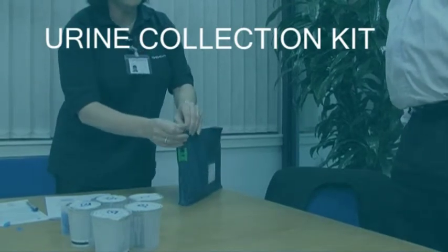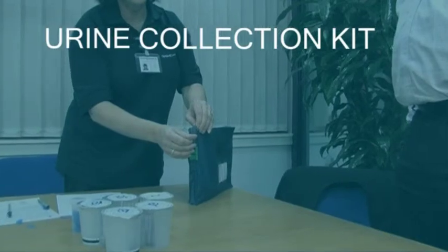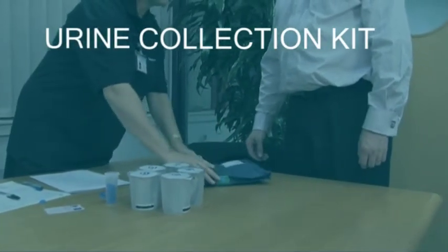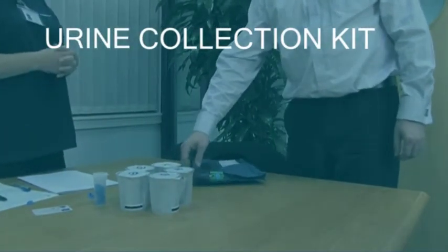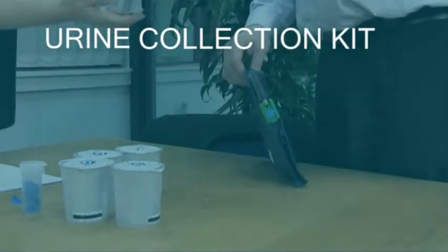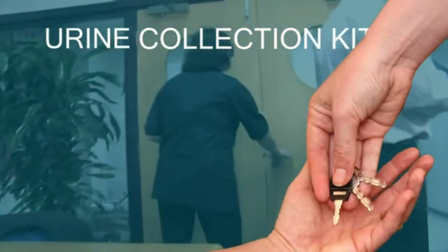You will ask the donor to empty the pockets of any remaining clothing. You do not want to know what people have in their pockets, merely that their pockets are empty and remain empty while they are voiding the specimen. You can invite the donor to take the sealed bag into the collection area with them, or if a lockable drawer is used, give them the key for safekeeping.